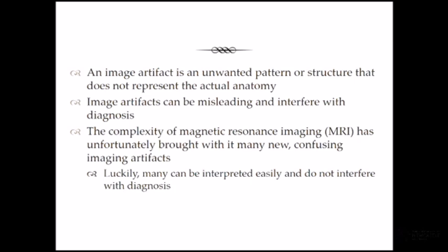you might have a radiologist come to you and say, so for instance, a really good one is when you are scanning in the abdo, and at the first slice on your run in the aorta, you'll see a signal, depending on how you've set up your scan. I can't tell you how many times radiologists have come and said, you didn't scan enough volume, there's pathology. And you go, no, that's not pathology, that's inflow artefact.